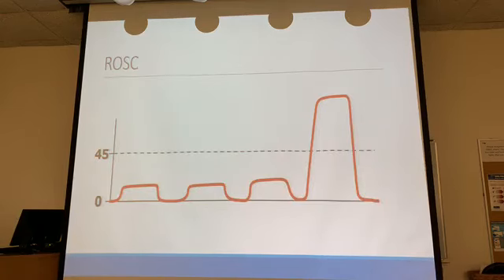So this is what ROSC is going to look like. You'll have a waveform there, and then all of a sudden it's going to spike up. I got ROSC back on this patient.